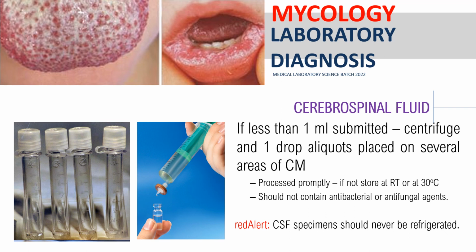And then, ito class, pakitandaan, if less than 1 ml submitted, use centrifuge and 1 drop of aliquot placed on several areas of your culture media. Okay? And then, process promptly, dapat promptly class. And then, if not, store at room temperature or at 30 degrees Celsius. And then, should not contain antibacterial or antifungal agent class. Bakit class? Importante to class.